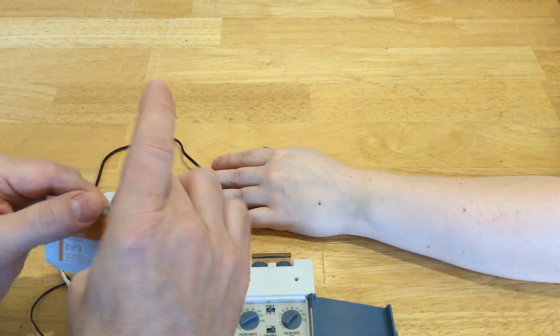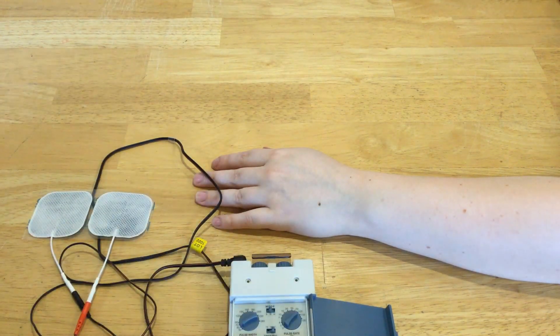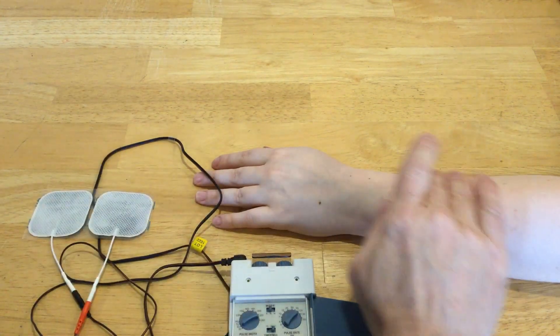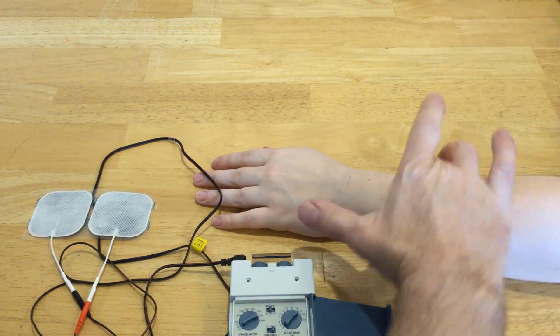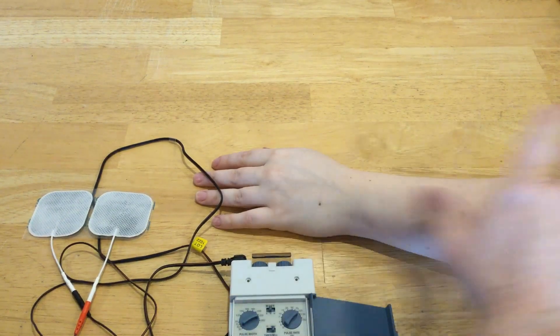First thing you want to do is clean your client's skin with an alcohol wipe to get off any lotions, dirt, or oil that might be there. So I'm just going to do that a minute, clean that off where I might put this.